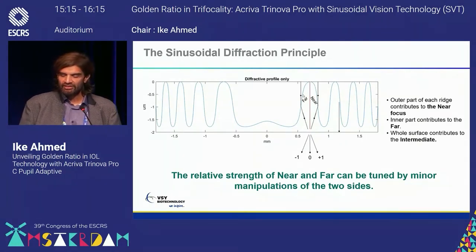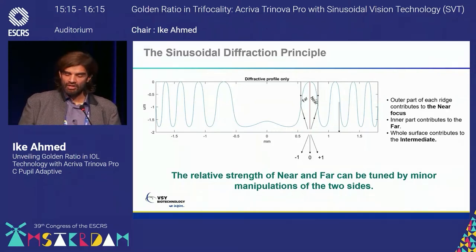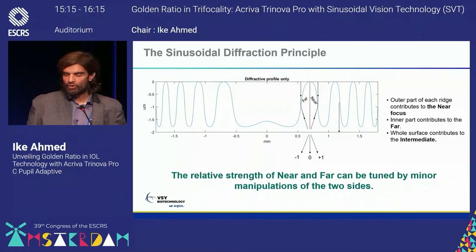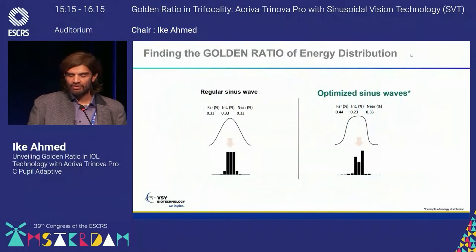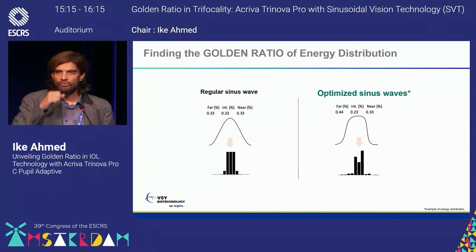What you'll see is that the different parts of the ridge contribute to the different focus distances. You see here on the outer part of the ridge is the near focus. On the inner part of the ridge is the far focus, and the whole surface contributes to the intermediate. We can tune this to the amount of energy delivered for each of these foci point, which I think is very, very clever. We all know on the left the regular sinus, normal sinus wave.